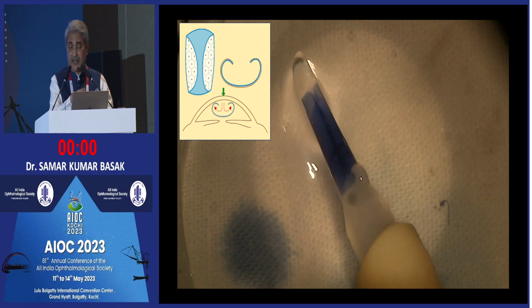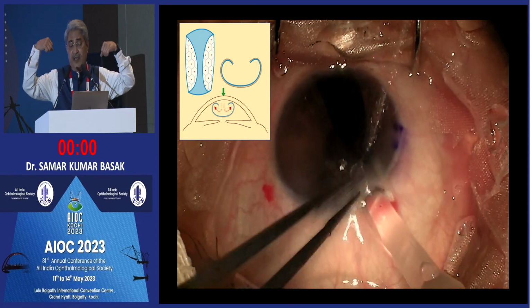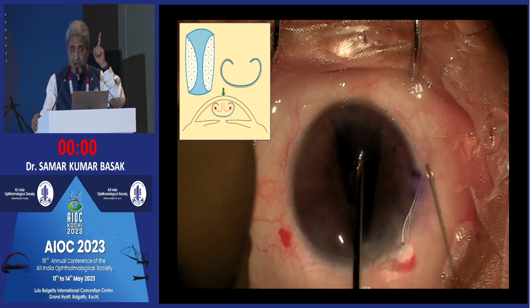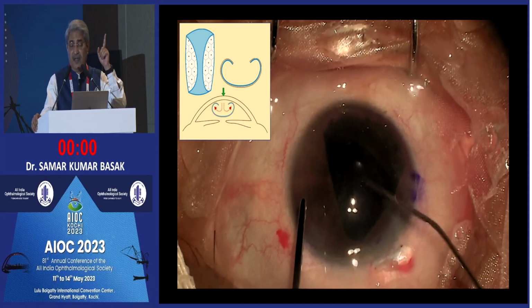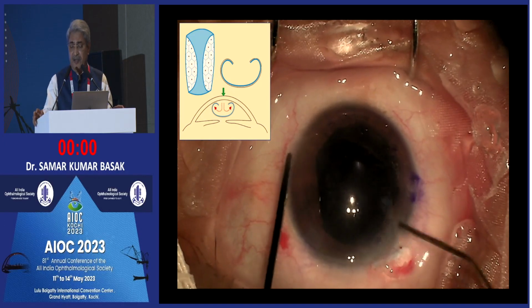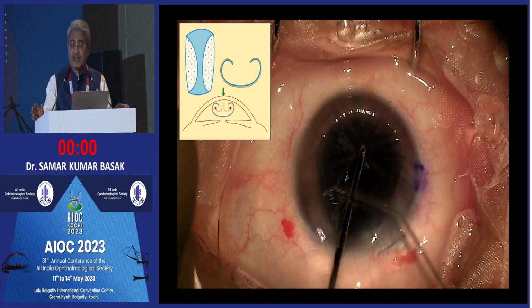No, this is again the same, but it is with tapping. So it is like this. Same thing, not with fluid release, but you tap, you place one hand right at the middle. Again, almost the same as the previous one. You know that you are in the right direction. It is very difficult to see in our eyes, to see the mark, the asymmetric mark.